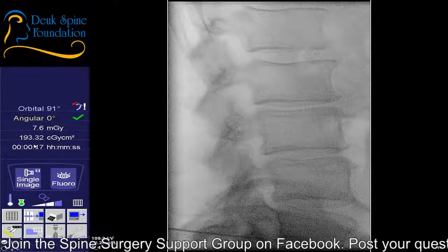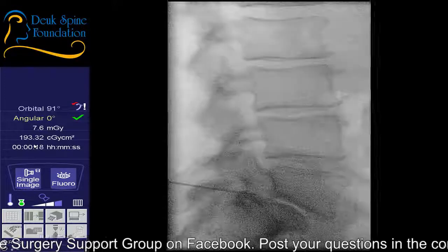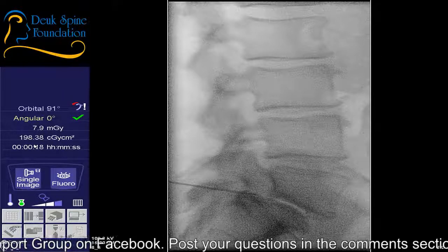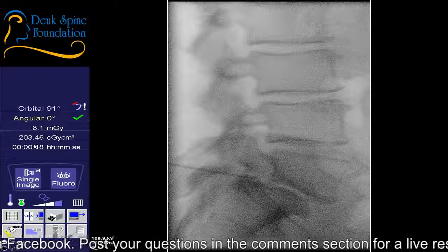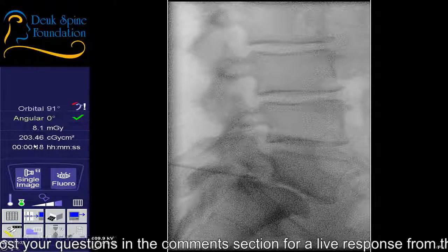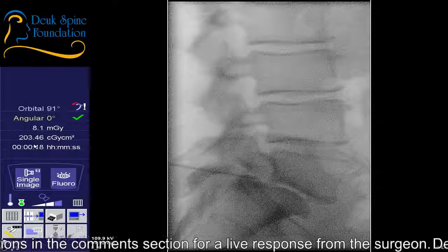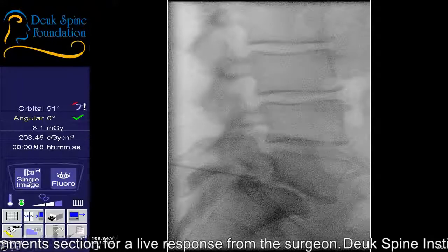Did I overshoot on the crest? No, I overshot on the crest. All right. Well, let's lock it there and see what we can do. The pelvic area is a little bit off. Are you comfortable? Are you comfortable?